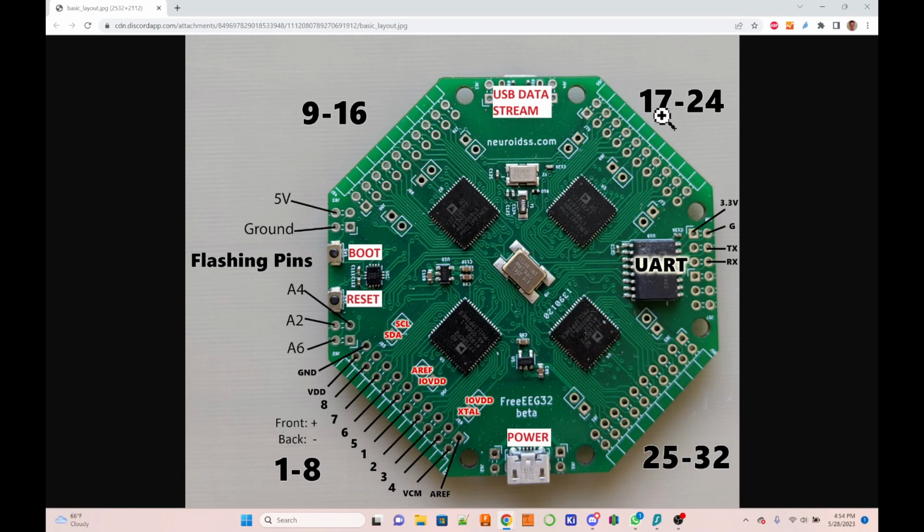And then we turn to this side. Here we have channel 17 to 24. So again here, this would be 17, 18, 19, 20, 21, 22, 23, and 24. And here again, because this is clockwise, here we have 25, 26, 27, 28, and then 29, 30, 31, and 32. So they're all exactly the same if you turn it 90 degrees every time. So there's no mirroring. This is just turning the system 90 degrees every time for every ADC.